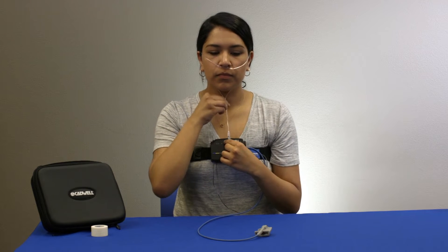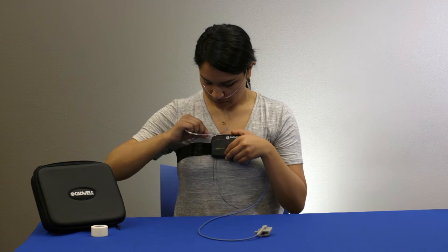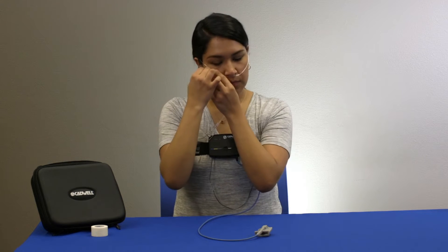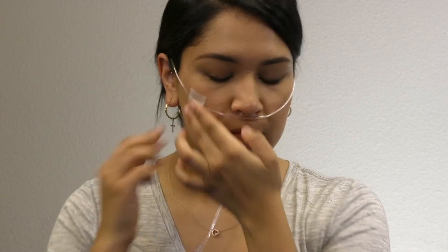Slide the tension adjusters up the cannula tubing and attach the cannula by gently twisting the tube onto the metal connector on the top of the apnea track. Tear off two small pieces of tape and secure the tubing to your cheeks.